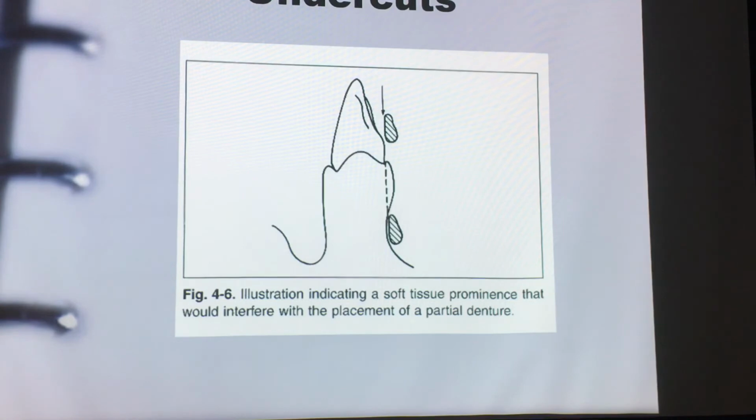You can see the lingual bar here, and then going down further in this direction, that it's going to hit this tissue. If we put the bar right 0.3 to 0.5 millimeters off the tissue, which you know it is. So in this case, the lingual bar would have to be out in this area here. Sorry for the sloppy drawing. But it would be out there, and then now we don't have our 0.3 to 0.5 off the tissue, creating a huge speech impediment and food impaction.